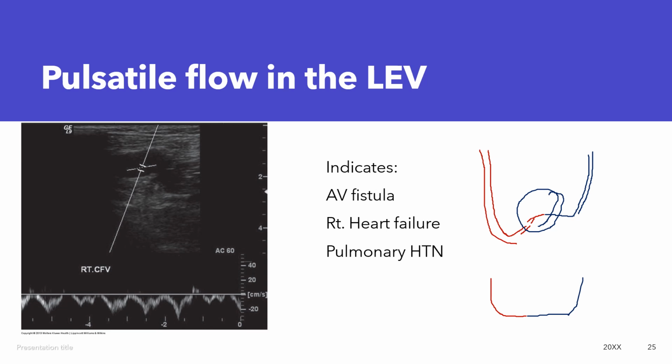If this is occurring in my lower venous system, you can imagine that that pulsatility from my arterial system is not broken down as it goes from smaller and smaller arteries. So I will notice that pulsatility in the venous system as well. So that's our AV fistula, and that's why you would see something that looks maybe a little bit more like this, more pulsatile than expected.